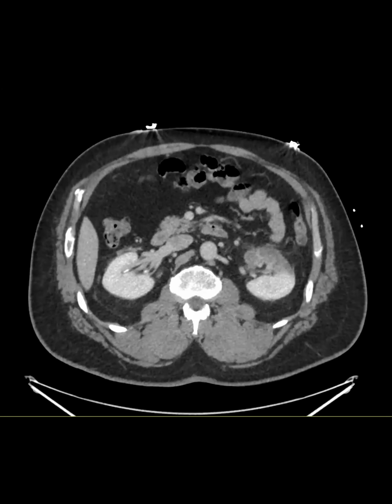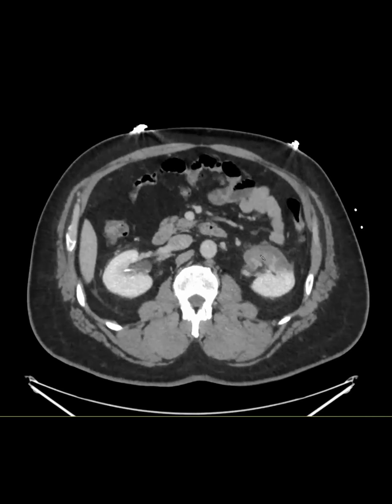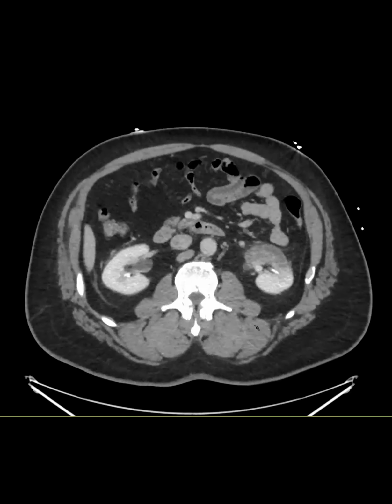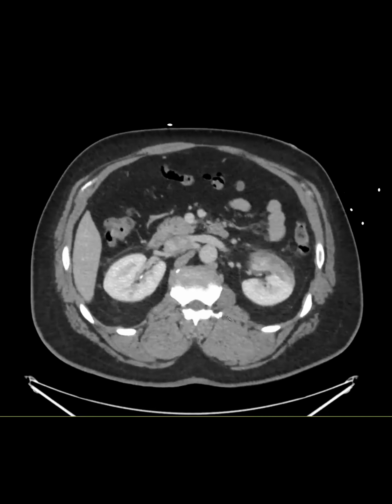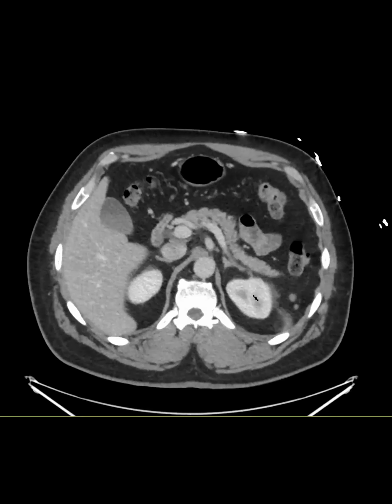Okay, can you guys see my screen? Yeah. Okay. So this is my first case, and you can see the finding pretty easily here. We see this hypoenhancement of the kidney, a little bit of a rim sign, so a little bit of preserved enhancement of the rim. And so we called this a renal infarct. The patient didn't seem to have any vascular disease. Their renal arteries looked open. I could trace them even though this wasn't a CTA. And the other interesting finding is up here.